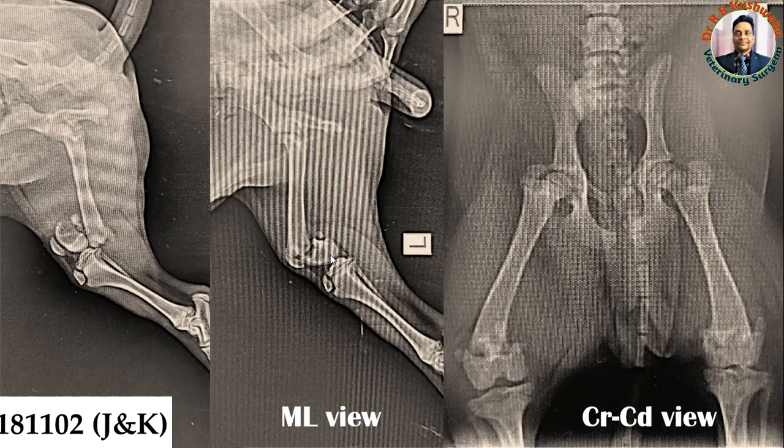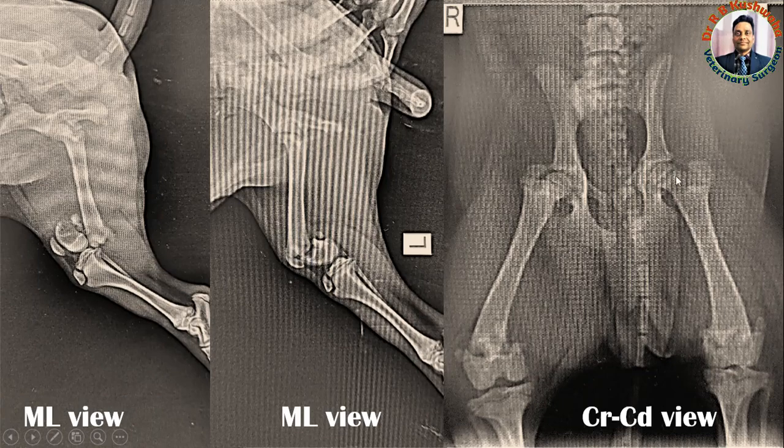In the left femur bone, the condyle deviated caudally whereas the proximal fracture fragment deviated slightly cranially. This is the craniocaudal view of both femur bones. For this view, the animal is positioned in dorsal recumbency — both hind limbs extended and pulled caudally to expose the cranial surface of the femur bone.